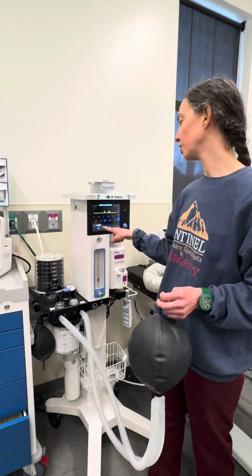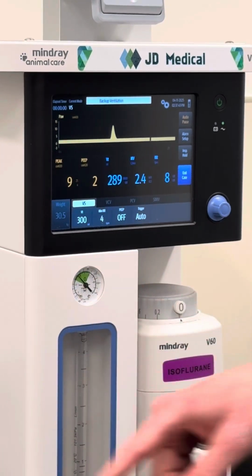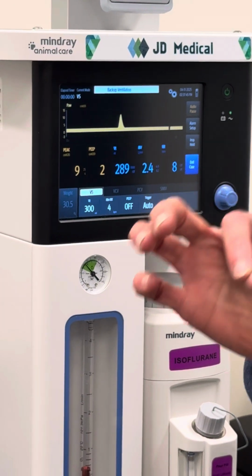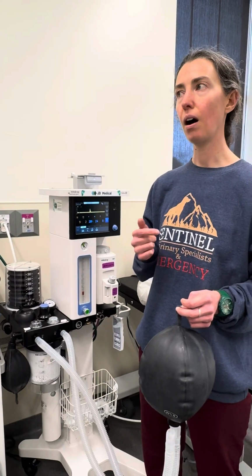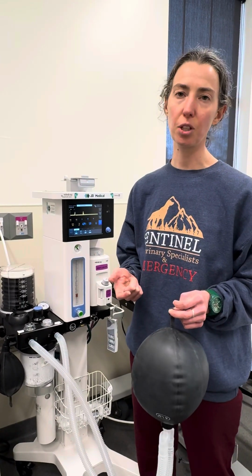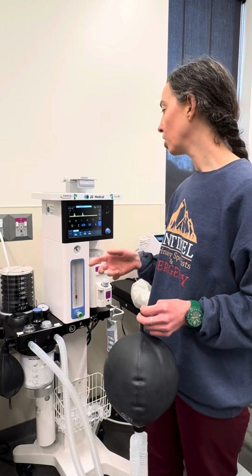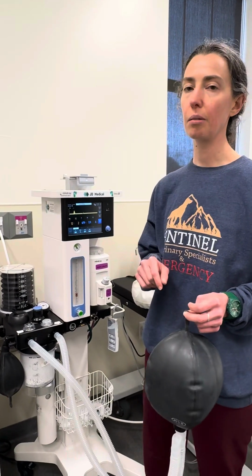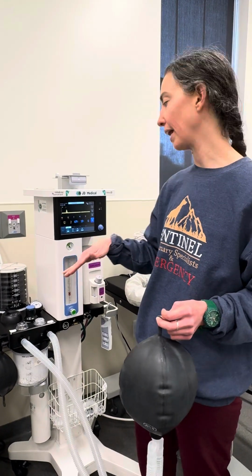And it has right here, it says minimum respiratory rate. And so you can tell it the minimum respiratory rate you want to have. So if the patient doesn't take a breath, it's going to provide that breath to the patient. And if the patient triggers a breath, it's going to help that patient breathe. So that's what the machine is going to be set on when you roll into the OR and you throw the ventilator switch to automatic.